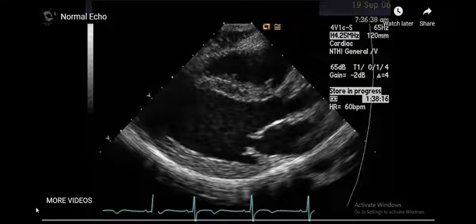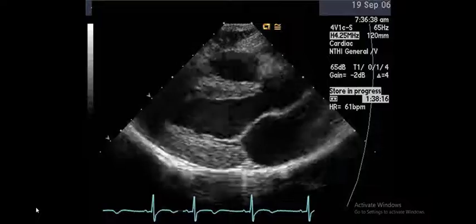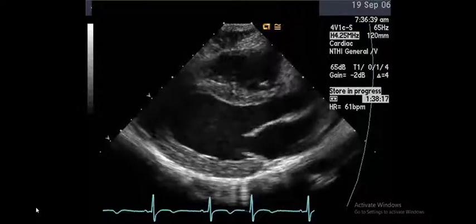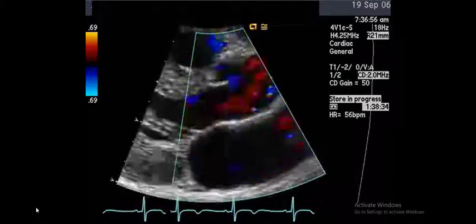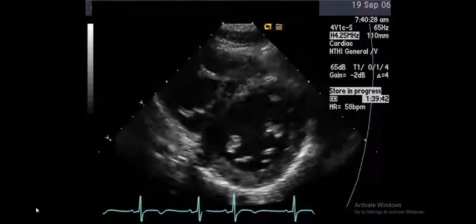An example that links bioimaging and signaling process is echocardiography. An echocardiogram is a sonogram of the heart. It allows the visualization of the internal structure of, for example, the fetal heart by creating images using the standard 2D, 3D, and Doppler ultrasound. It lets us see also the heartbeat signals.